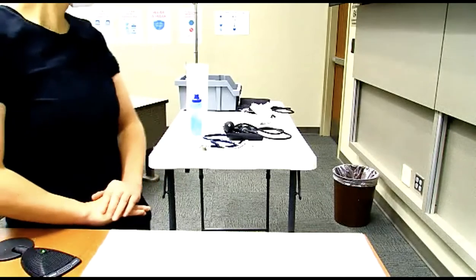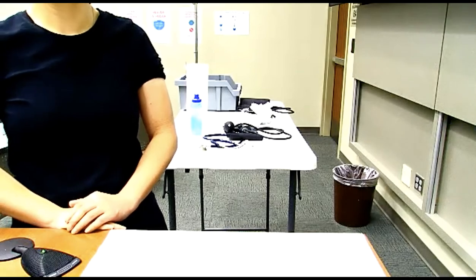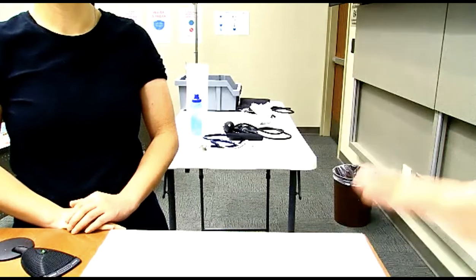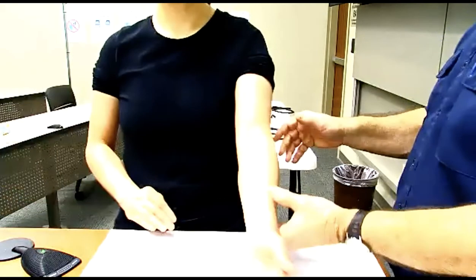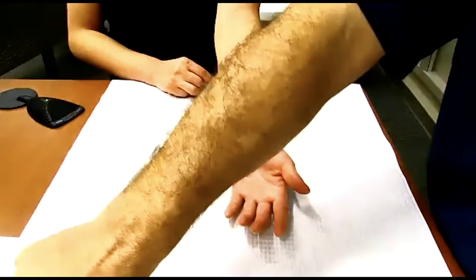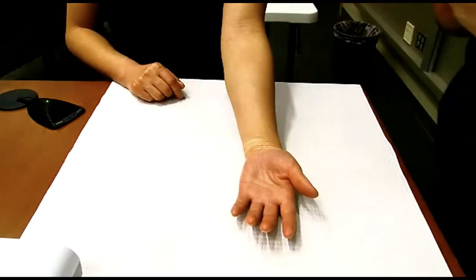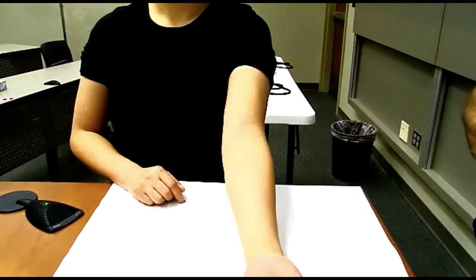All right. Now, step two says to position the patient. All the patients will be sitting down. The big thing is you want your patient sitting with their legs uncrossed, feet flat on the floor, back straight. So you don't want them slouching, but you also don't want their legs crossed. You're then going to have your patient come over here, and we want to rest their arm supported on the table, at the level of the heart. So the blood pressure cuff here is going to be at the level of her heart. Okay, so she's there. Step two, position the patient.